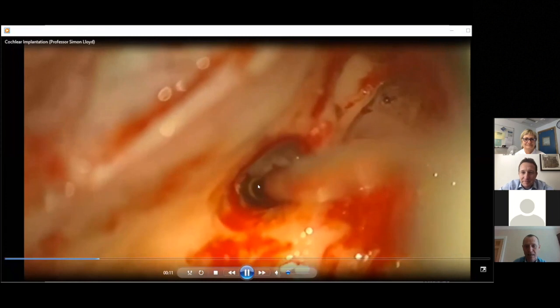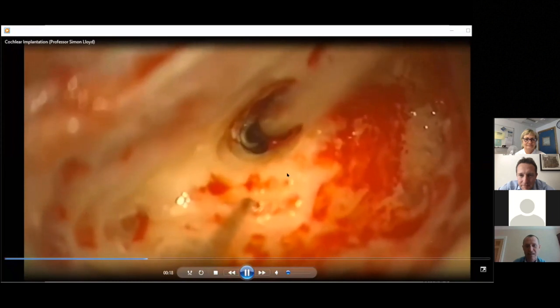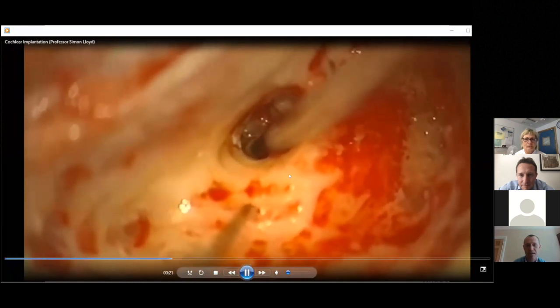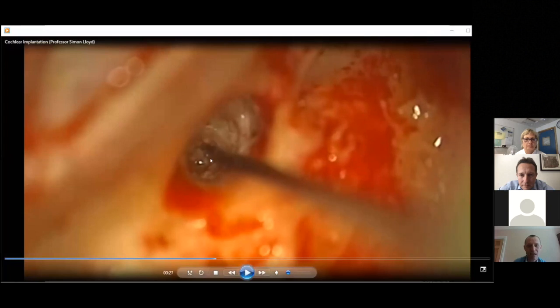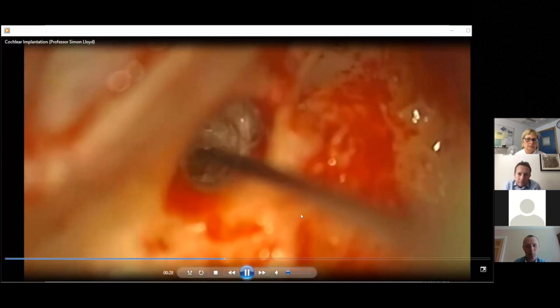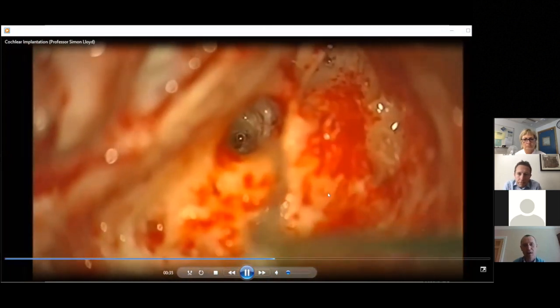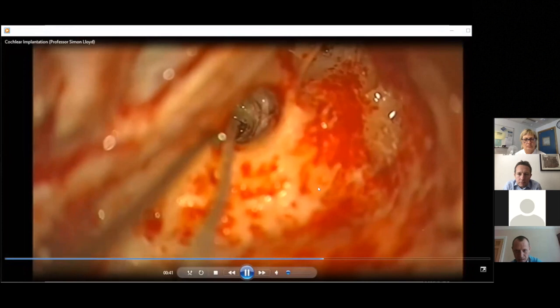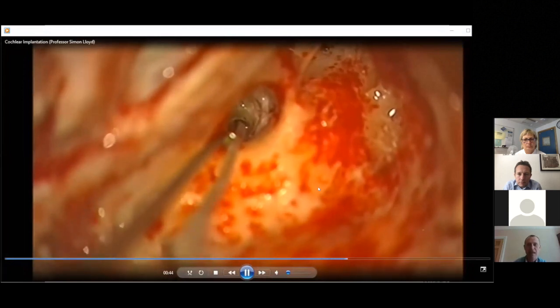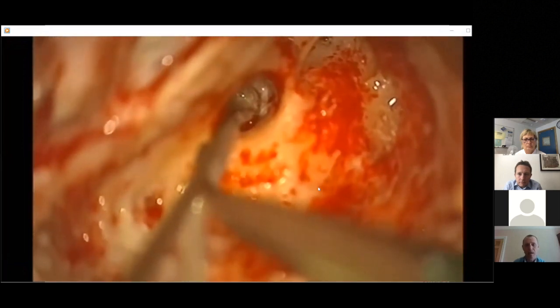So we've got the promontory here and just using the skeeter burr, here you go, you start to see the round window in the depths there. There we go. So I'm just going to pause it for a sec. Here we go. So the round window's there, and here you're just using a needle to make a little hole in the round window. Usually we use a little bit of dexamethasone around just to try and help with preservation of vestibular and cochlear structures. And here, the electrode tip is just being fed into the cochlea and slowly pushed forward until it's fully inserted.